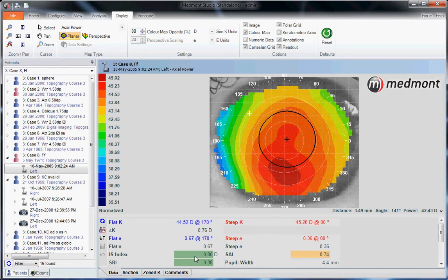When your disease detection indices are green, this indicates the patient falls within normal range. When you have yellow, it's cautionary. When you have red, it's abnormal.